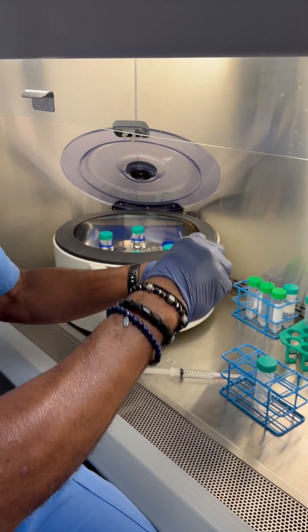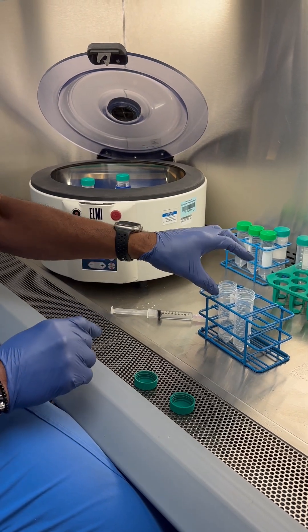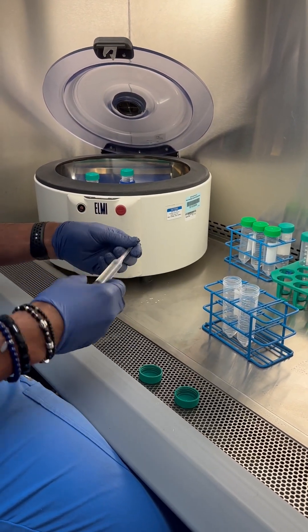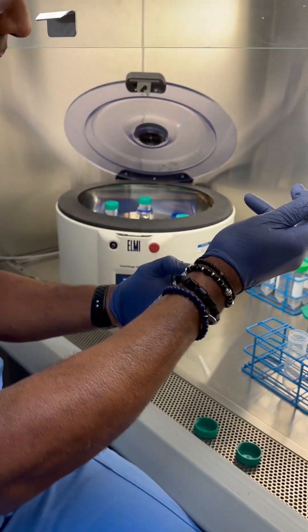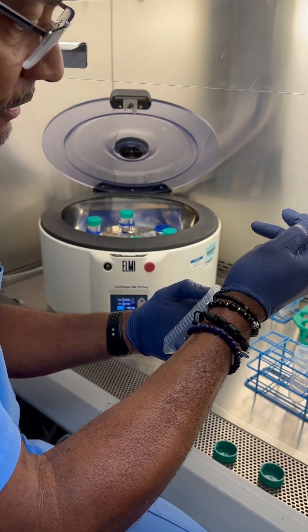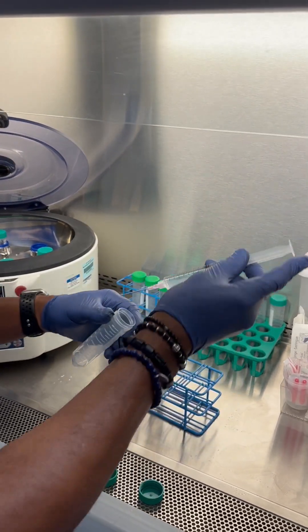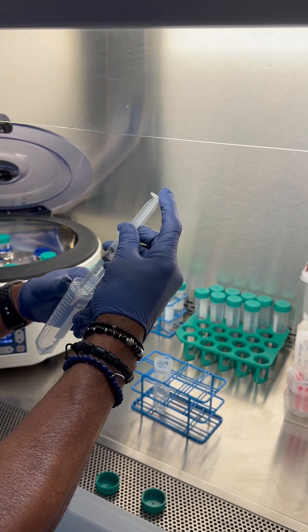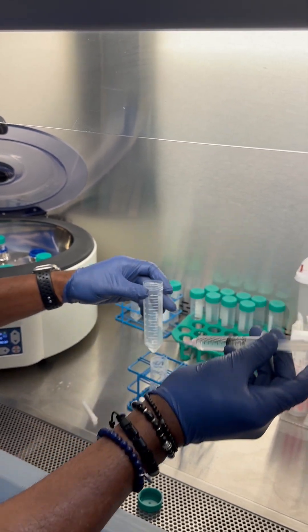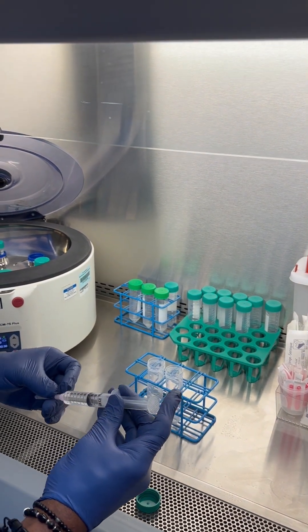These are empty sterile test tubes. Normally when drawing 60cc we only need one, but because we did 120cc we need two. We're going to add ACDA — one and a half cc's of ACDA per tube. So each one of those empty tubes has one and a half cc's of ACDA.